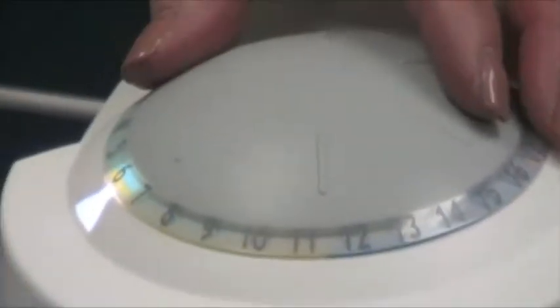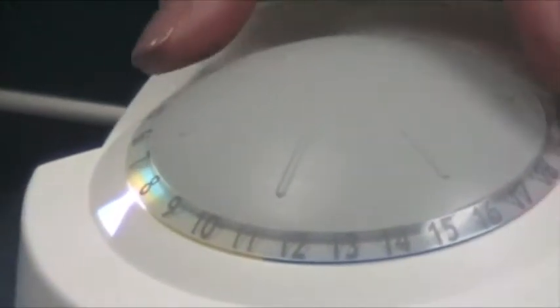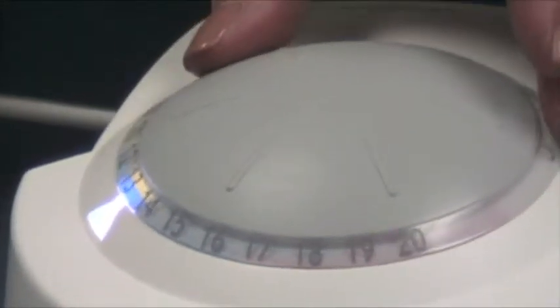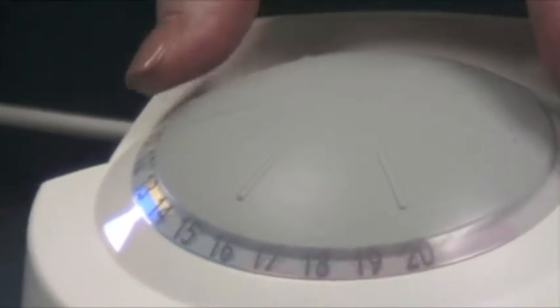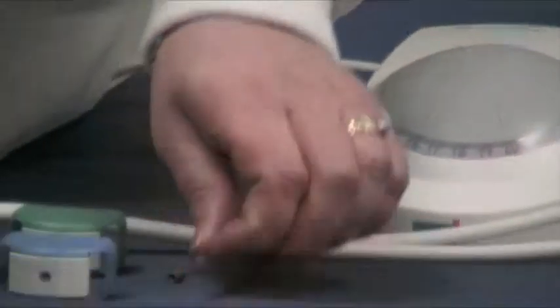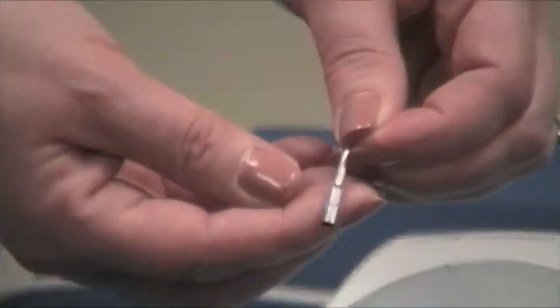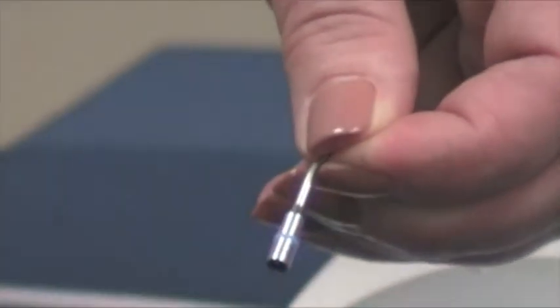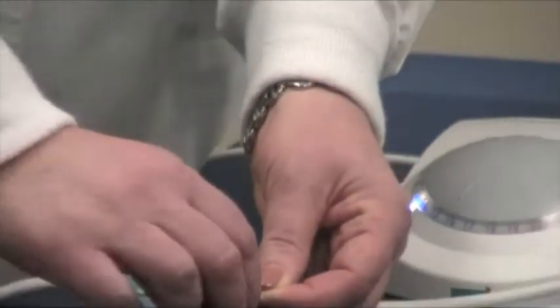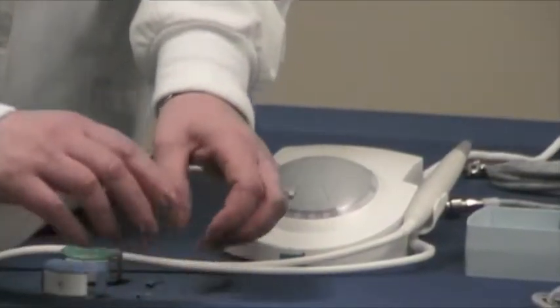Our second level is yellow — that's medium, and that's for endodontics. Our third level is high — that's blue for scaling. We have one of our scaling tips here. As you can see, it has the blue band, which coordinates with the blue wrench, making it easy to identify the proper power setting for the job that you're doing.